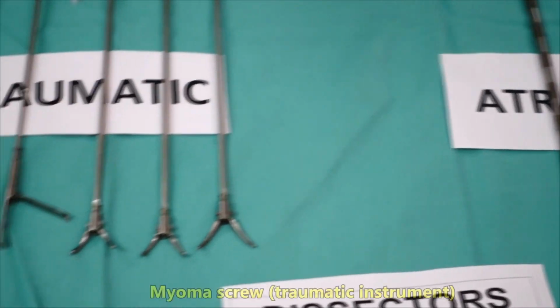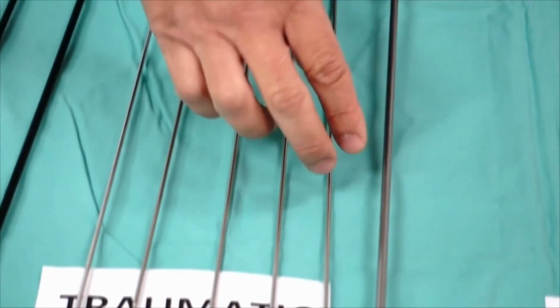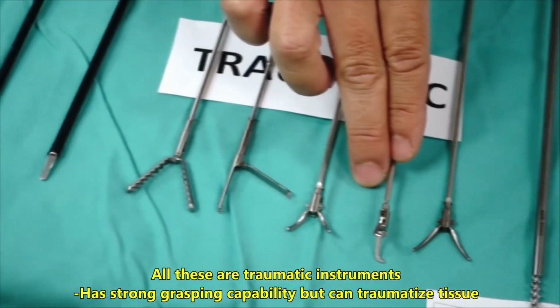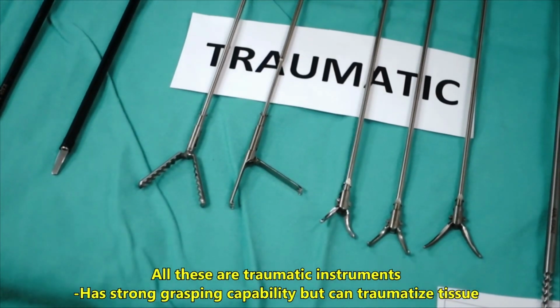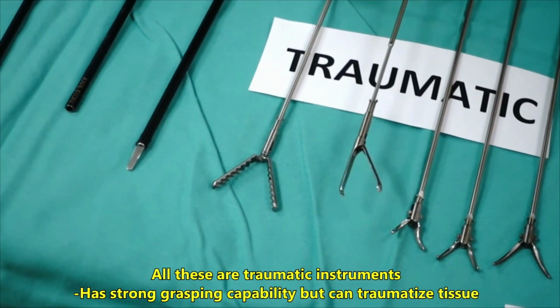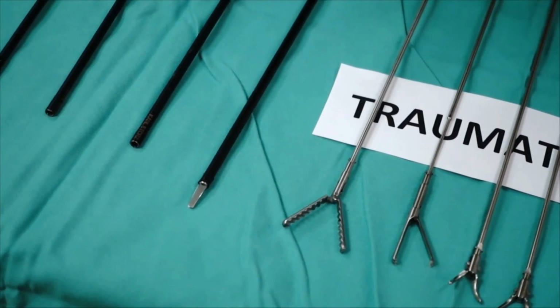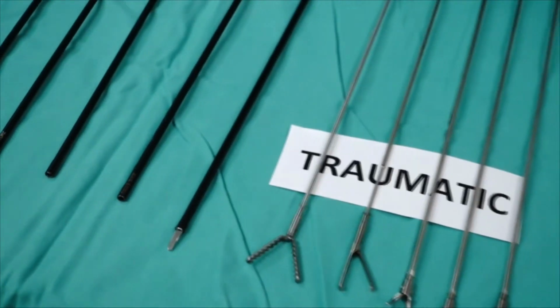Now the myoma screw, okay? Threaded myoma screw is a traumatic instrument. This is your Maryland. This is your right angle, okay? You can see that. This is your Kelly. This is your claw, right? And this is your alligator forceps. So these are traumatic instruments.